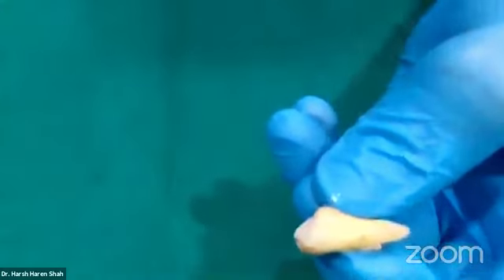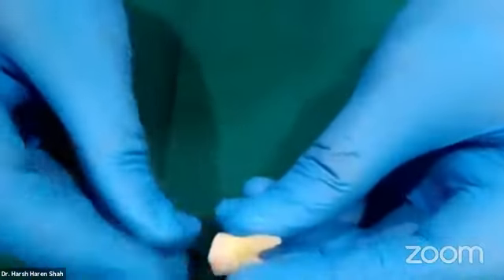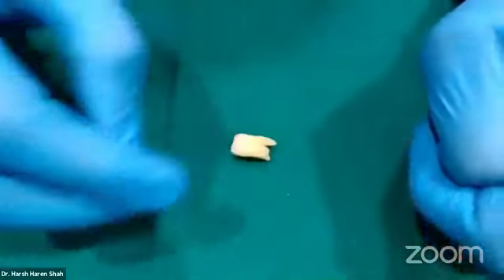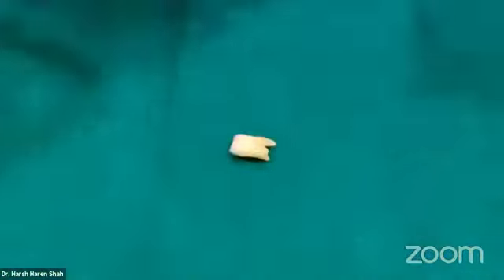Well, that's about the preparation. 3 methods, you choose whatever works for you best. Manual files are going to be the slowest. Your manual K files used with your 2 fingers will be the slowest, but it will be the most economical as well. Use of something like a K400 reciprocating handpiece will provide you some amount of speed. It will also make it much less fatiguing for you.